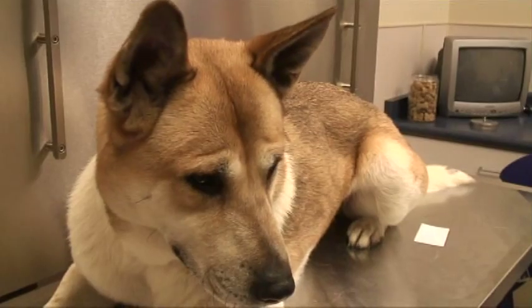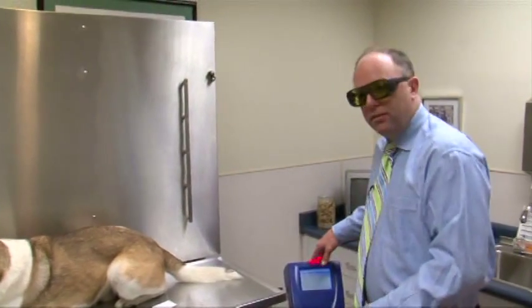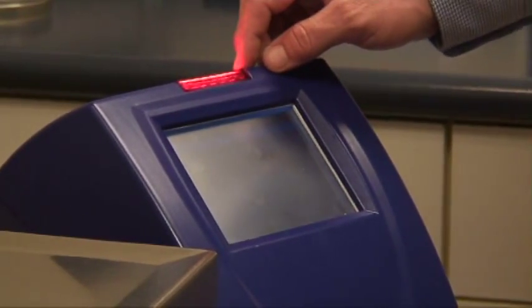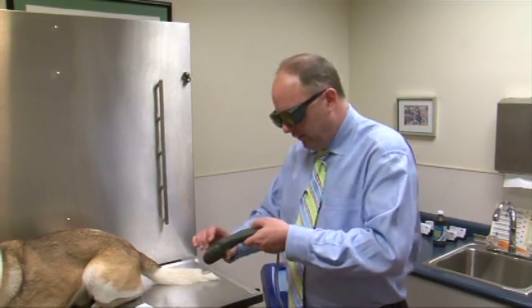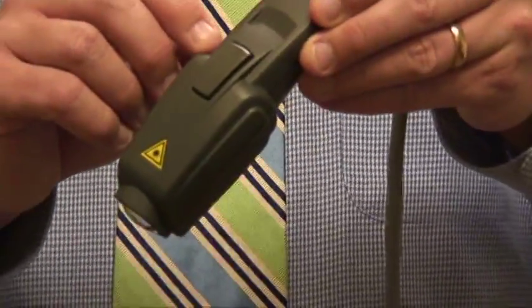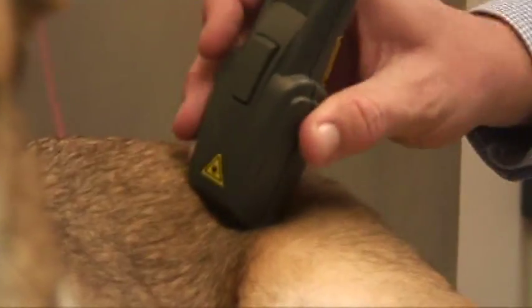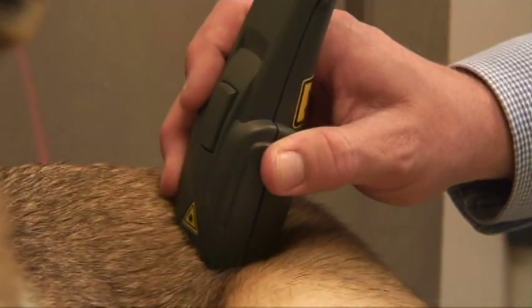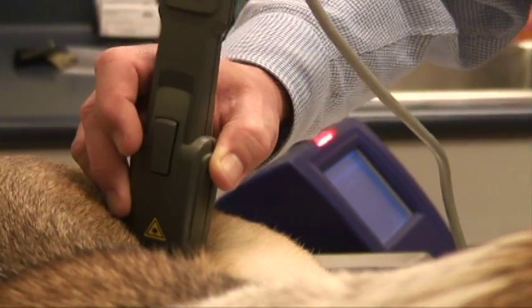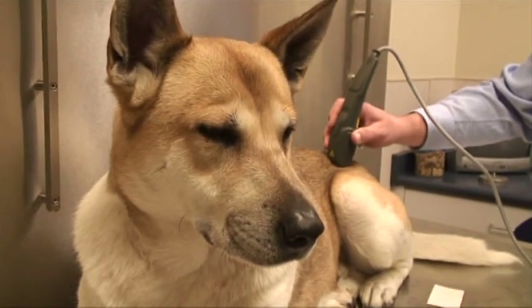As we deliver a real treatment, we're in point-to-point mode. I'm now going to start the treatment for this particular animal. It's going to give three indications and beep audibly. We're also going to see a red light on the top, which means the laser is ready to fire. I'll use the handle to start the laser energy — I can also stop it. You do not need to hold the button down while delivering the treatment. Since I'm doing point to point, I will not be moving the probe. I'm going to hold it on this particular area for 30 seconds, keeping my eye on the timer. At the end of 30 seconds, I'll move it to the second location.